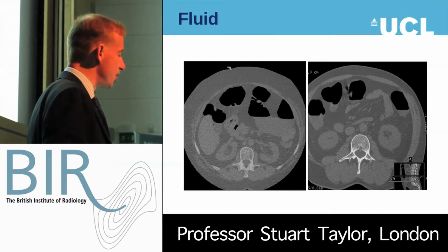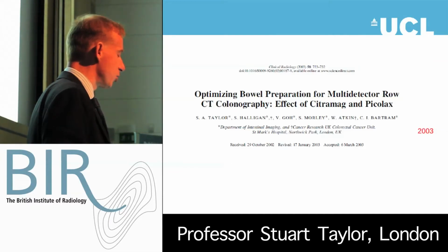And again, the early literature in the early 2000s was all about what kind of bowel prep to use, and we looked at Citramag and picolax and found picolax worked well.